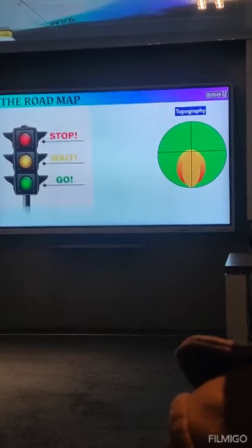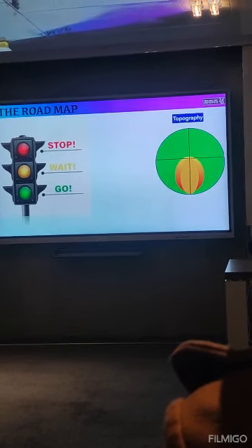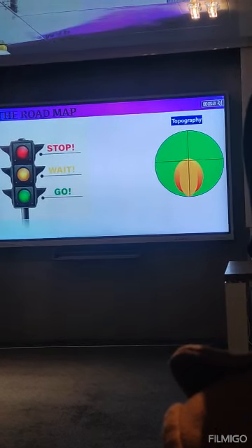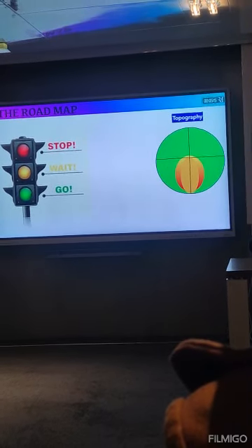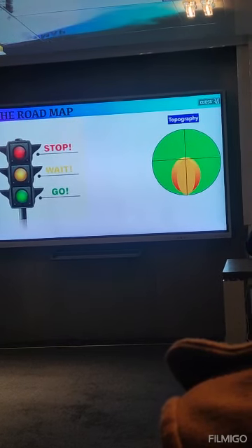The classification. This patient on the classification by the MS39 is absolute keratoconus. So there are discrepancies between them. Okay, this is very interesting. So there's a keratoconic patient with no option for refractive surgery, just for cross-linking.